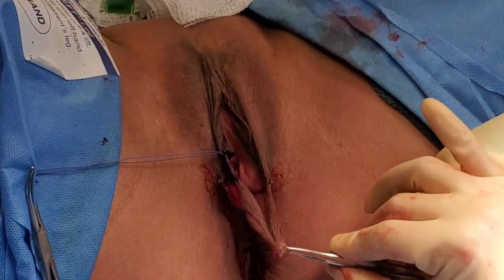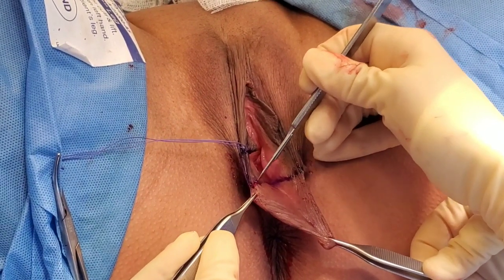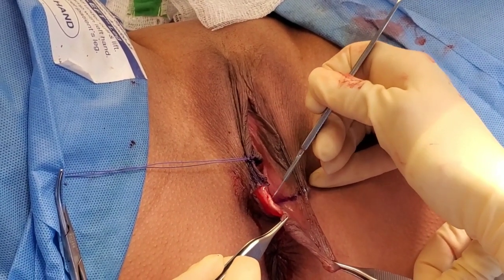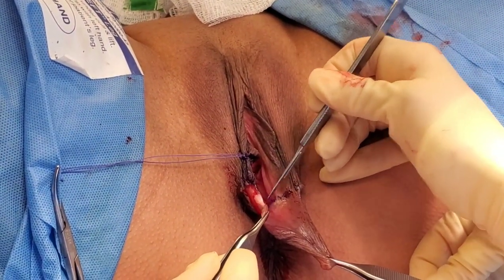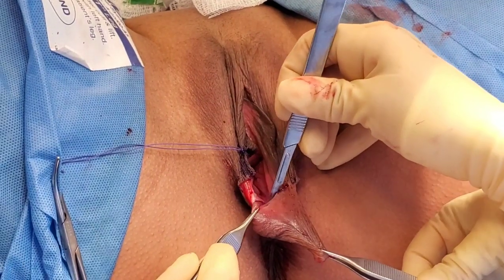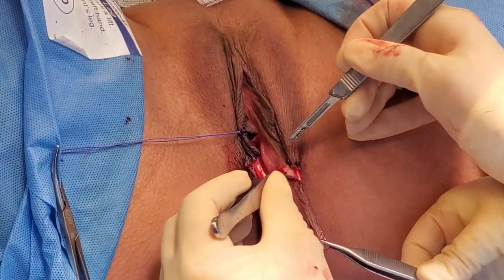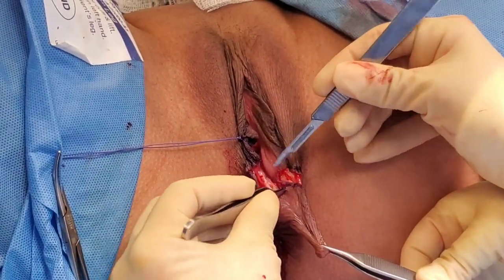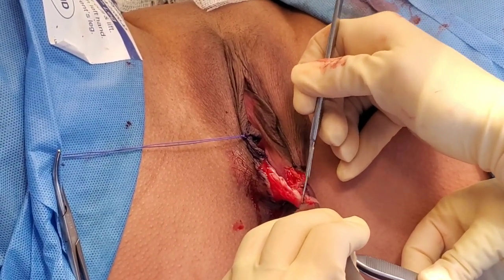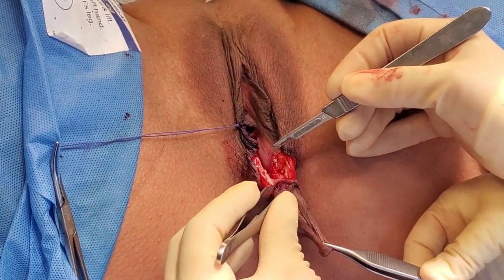I've already taken out this whole posterior part. Now I'm going to take out this part that's closer to the introitus, and since I've marked I can see where I want to go. The nice thing about the local anesthetic I used is that it has epinephrine in it, which helps with hemostasis, so this does not bleed as much. The recovery for this is pretty good — you have to tell patients it's as if they delivered again, because it's kind of like an episiotomy site injury. You cannot have sex for at least six weeks until all of this heals, and you have to be very careful with the sutures because they can unravel.